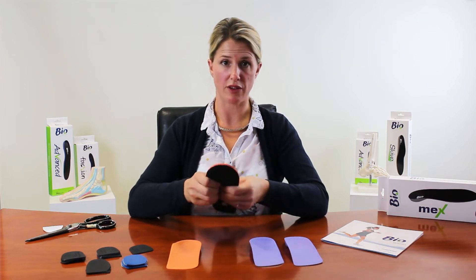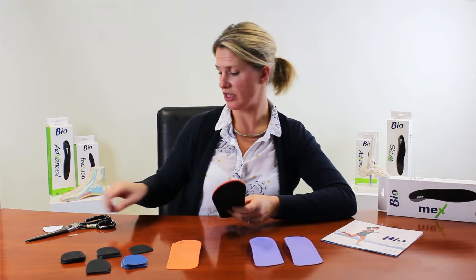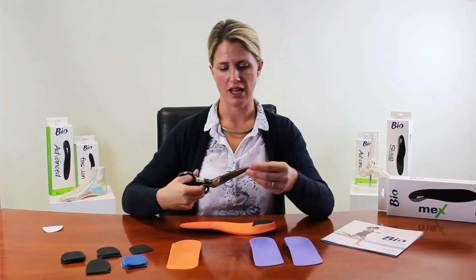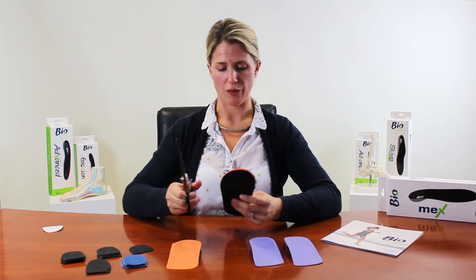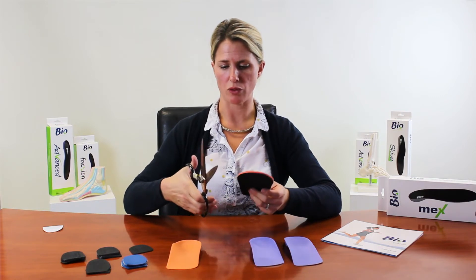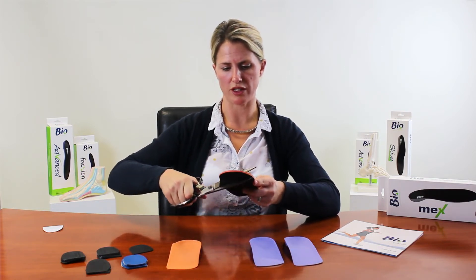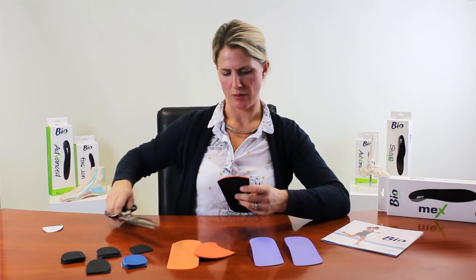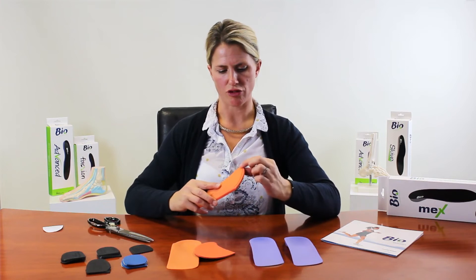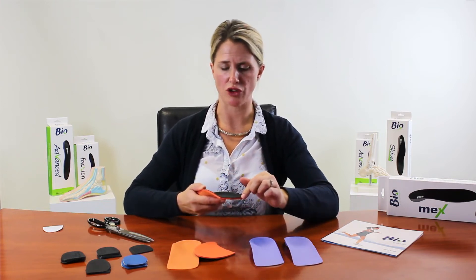If you want a three-quarter length device, it's easy to trim down. The tip is to use a sharp, long pair of scissors. By angling the scissors ever so slightly, you create a bevel as you cut, and if you get the scissors right in you can almost do it in one stroke. Creating that bevel means the patient is less likely to feel the distal edge.